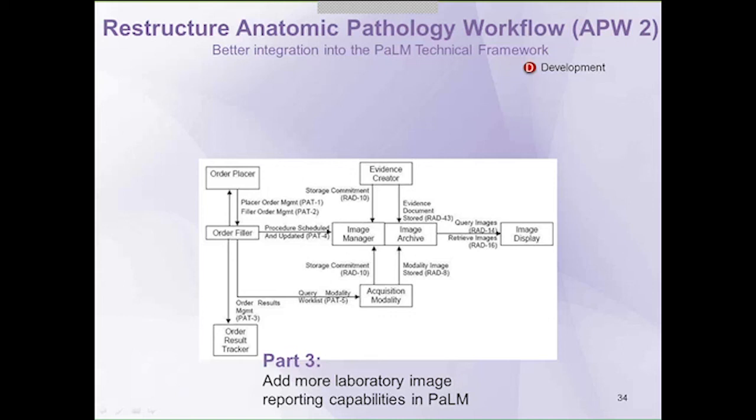In radiology today, there is the concept of a PACS system, which is inherent to the workflow of a radiologist. A pathologist will be leveraging digital pathology images, but they might not use a PACS system. They might use a PACS system only for storage and continue to use the LIS as the workflow device.